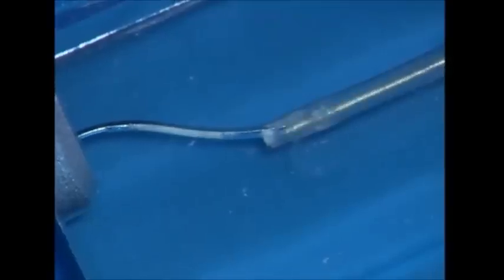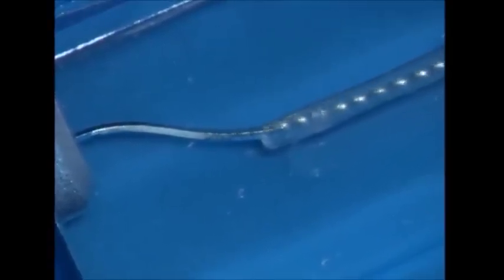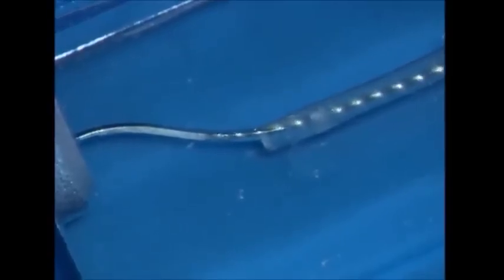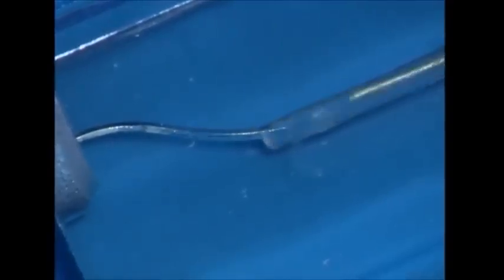Irrigate, recapitulate, and re-irrigate. It's important when pre-curved files are placed apical to the ledge to stay at this position and work the instrument deliberately and repeatedly, because this procedure refines and expands the glide path and makes it easier to introduce progressively larger instruments.